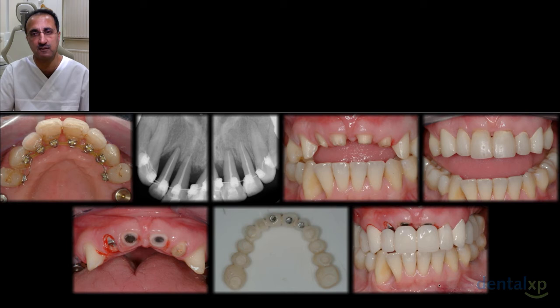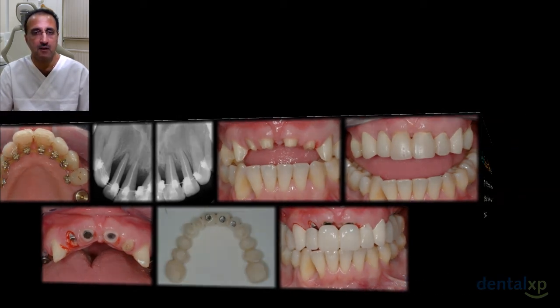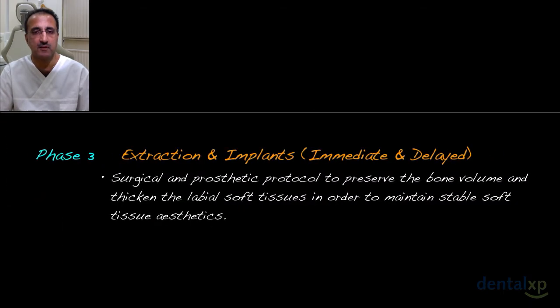And you can see us then cutting down the teeth, placing magnets in the roots, and leaving a space to allow these magnets to gently further extrude the tooth, because we want to bring its clinical attachment level more coronal to the level of the canines. And then we're ready to extract the teeth and place our implants.